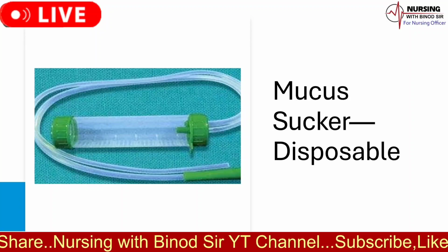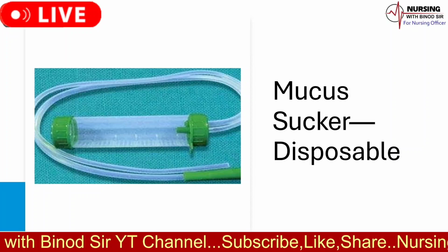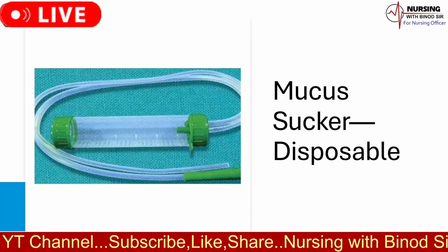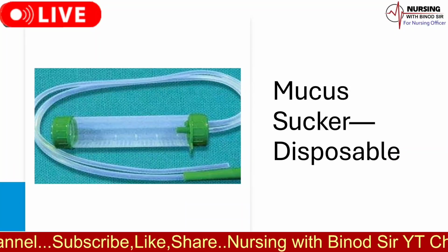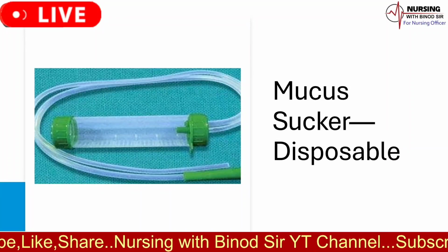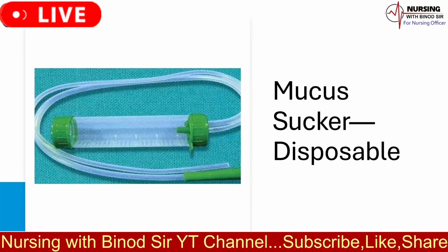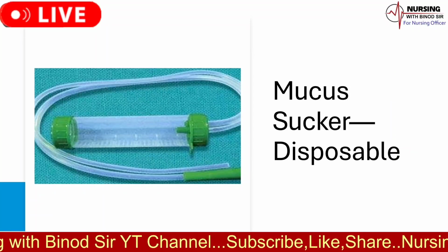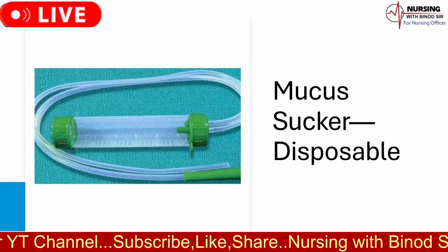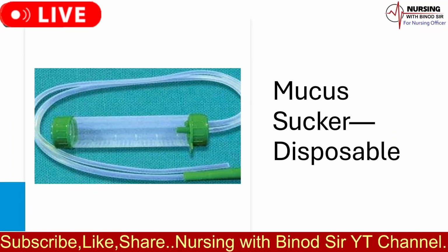3. Post-surgical care. Helps clear mucus in patients recovering from surgeries, thereby preventing respiratory complications. 4. Managing respiratory conditions. Assists individuals with respiratory conditions like sinusitis or bronchitis by clearing mucus from nasal and oral cavities. 5. Infant care. Essential in pediatric care to keep the airways of babies clear of mucus, ensuring they can breathe properly and comfortably. 6. Preventing infections. Regular use prevents mucus buildup which can otherwise lead to infections.